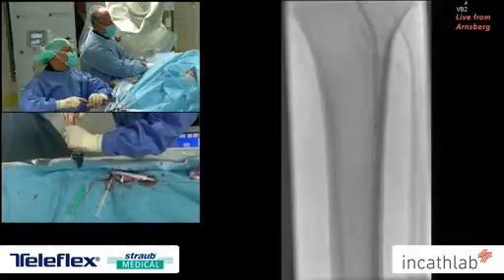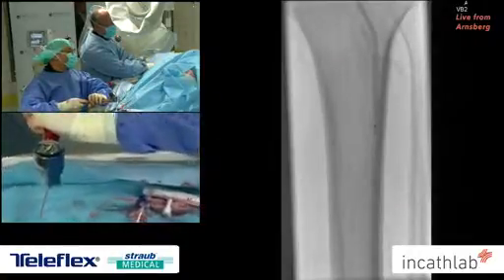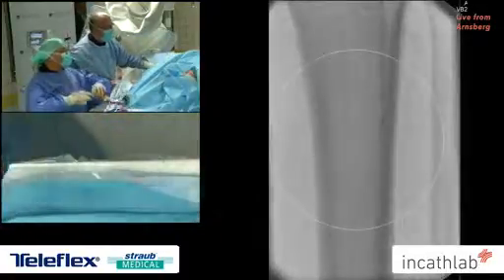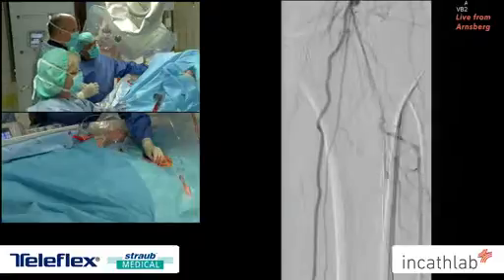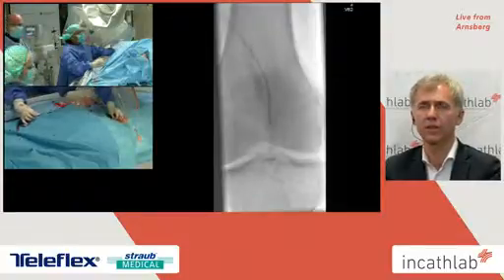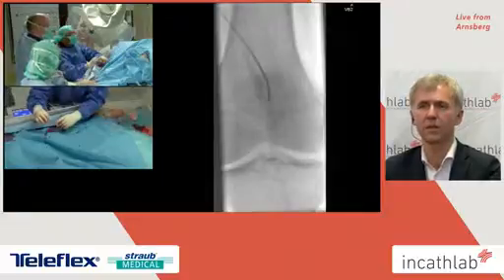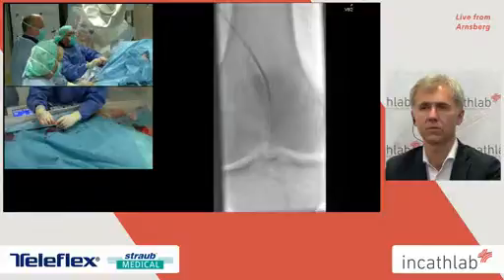So you can shift from an intraluminal progression to a subintimal progression, making a loop. It is safe in terms of not damaging your wire, as you may face when you use Outback or Off-Road or other devices where you should not use a wire with a polymer sleeve. But with this dedicated catheter you can use any 014 wire you like.